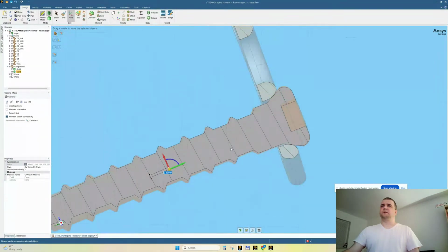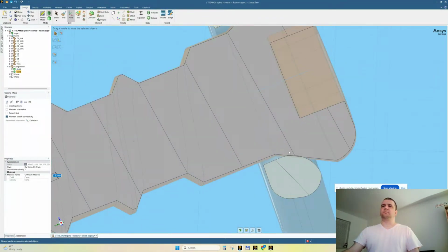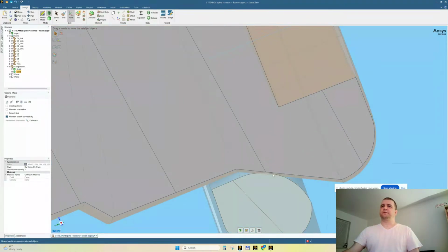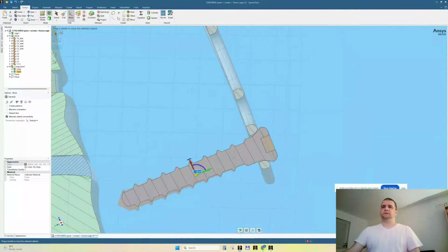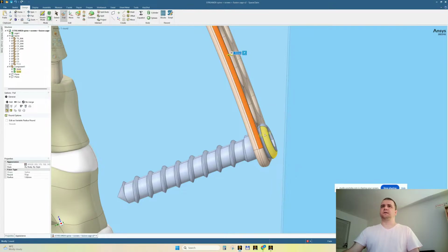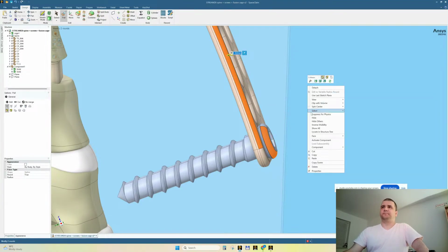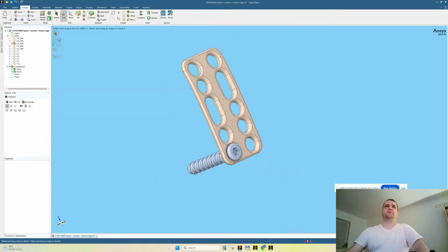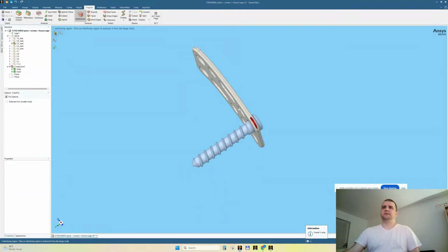Also it outwards a little because there is some contact, microscopical contact, but we always want to avoid collisions. So let's go here and let's ask. I selected with control pressed, right click, hide others, and I will ask the software for collisions. Prepare interference. So there is an interference.